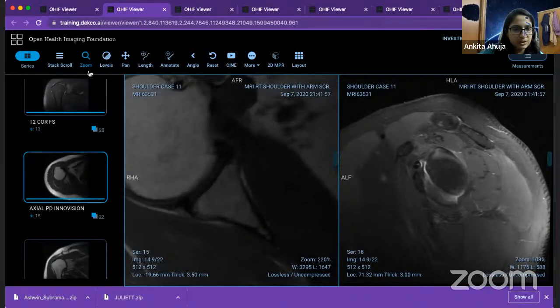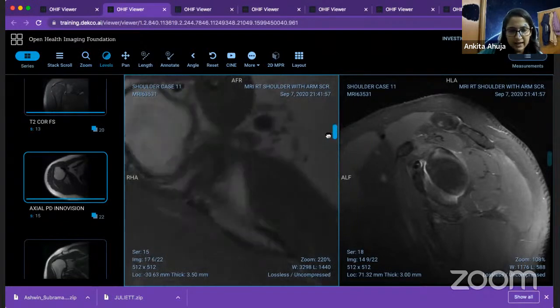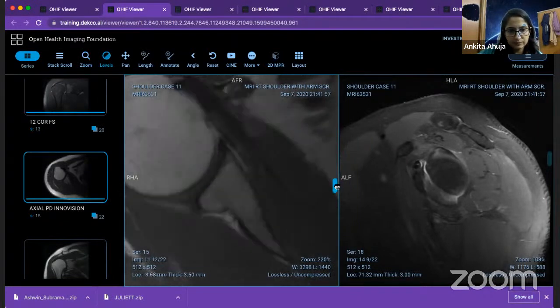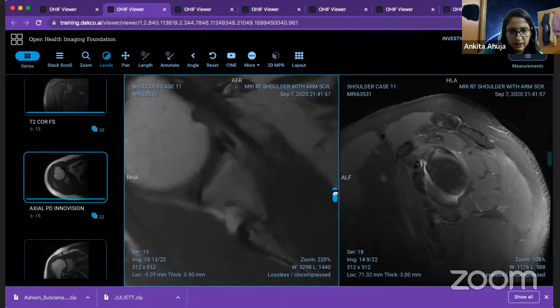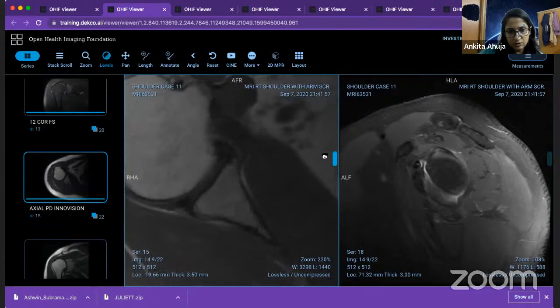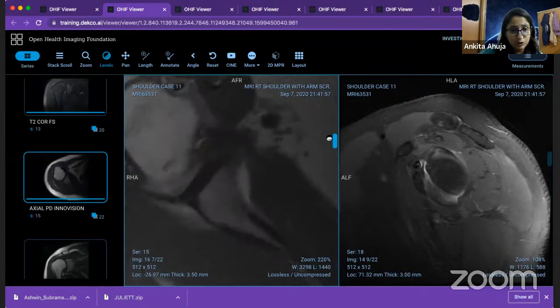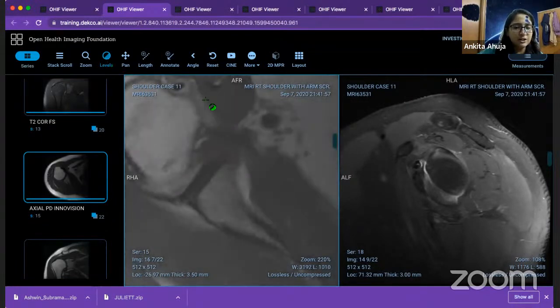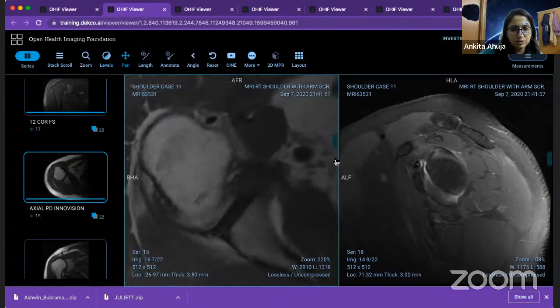So the patient history is also important. The patient has presented with restriction of movements and pain. As you said, there was superior labral fraying, and in addition, if you see here, there is posterior superior labral fraying also. So this can fit into one of your types of SLAP. That's okay, but that's not the cause of symptoms here. It's not labral signs which are bothering the patient.